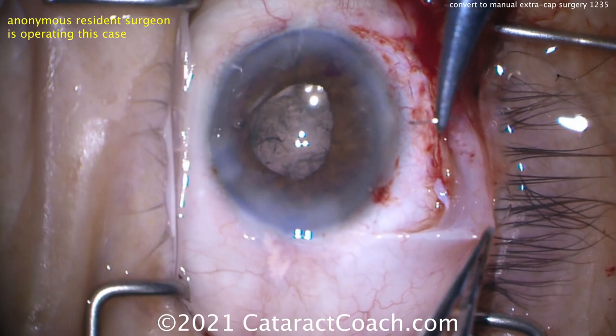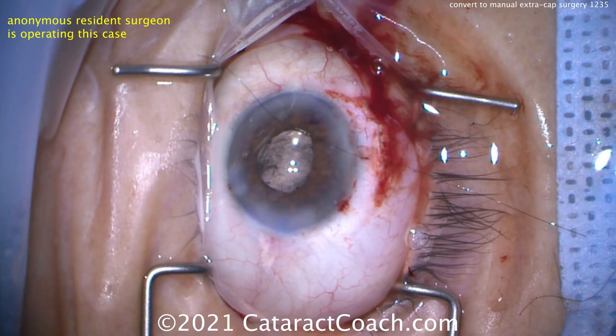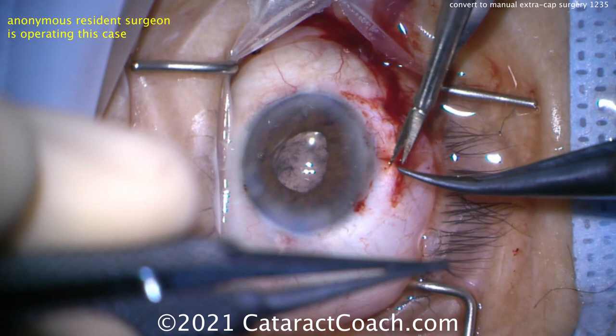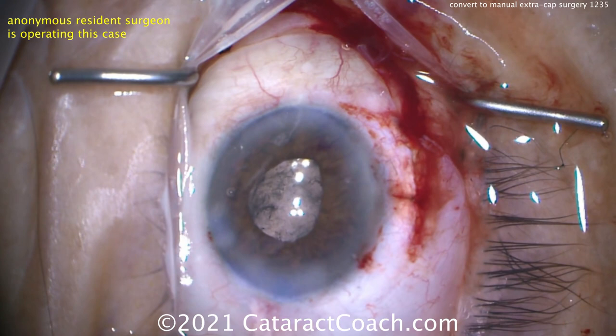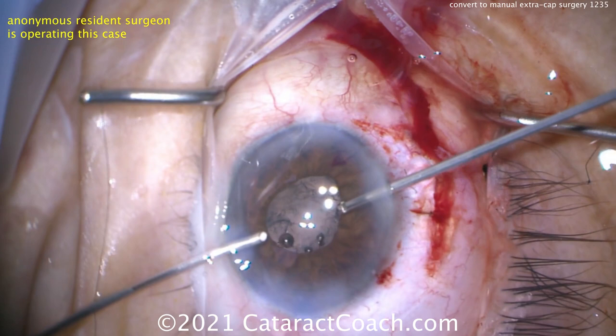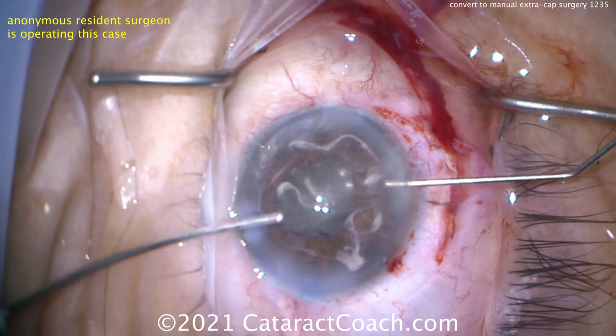No vitreous left in the anterior segment. The lens is in the appropriate position. Suturing up the main incision now. Prior to removing the viscoelastic, it's much easier to suture with the anterior chamber full of viscoelastic. Tying that up — the resident has done a good job practicing suturing. That looks pretty good. Now we need to remove the viscoelastic and complete the case using the bimanual anterior vitrectomy instruments on viscoelastic removal mode.